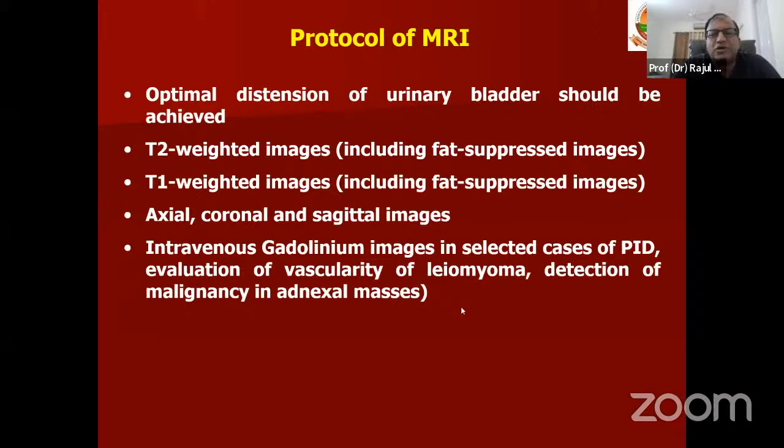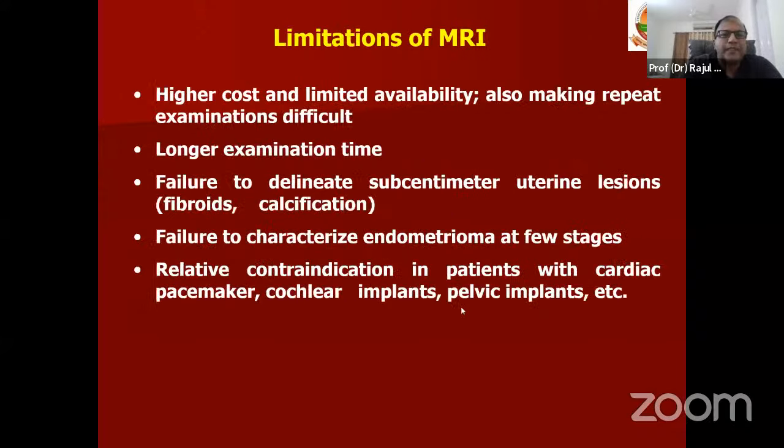Intravenous gadolinium, or intravenous MR contrast images, are used in selected cases of female infertility, specifically when pelvic inflammatory disease is suspected, or when we need to evaluate the vascularity of leiomyoma, or for detection of malignancies which are incidental in cases of adnexal masses.